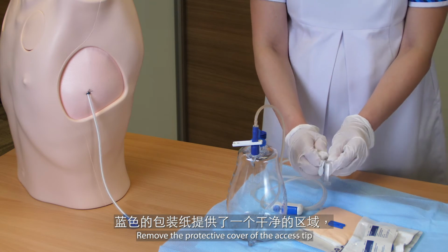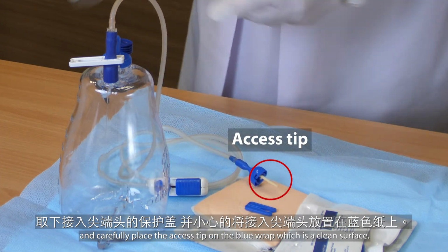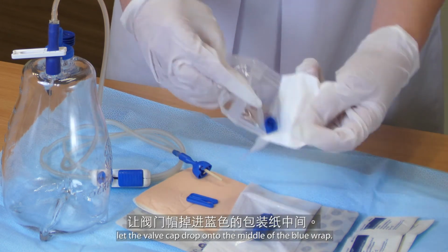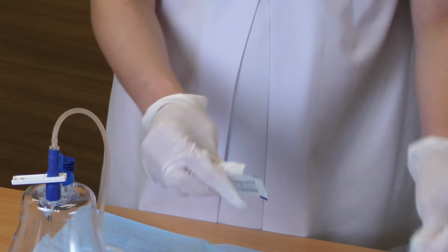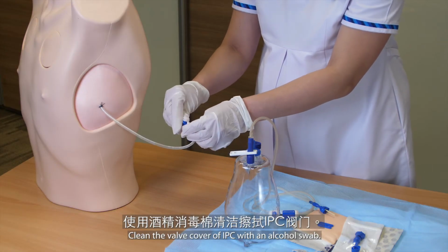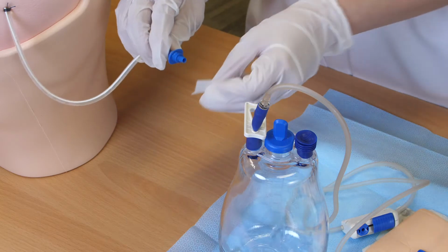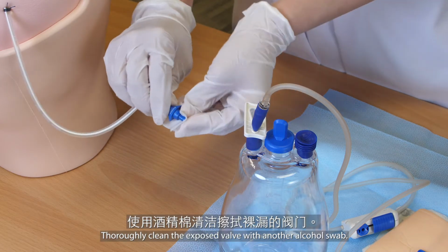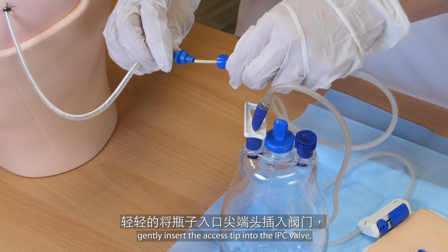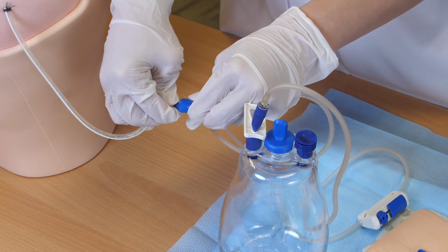Remove the protective cover of the access tip and carefully place the access tip on the blue wrap, which is a clean surface. Peel open the valve cap pack and carefully let the valve cap drop onto the middle of the blue wrap. Tear open alcohol swabs. Clean the valve cover of the IPC with an alcohol swab. Twist and gently remove the IPC cap. Thoroughly clean the exposed valve with another alcohol swab. Without touching the access tip, gently insert the access tip into the IPC valve using a twist and lock motion. A click should be heard.